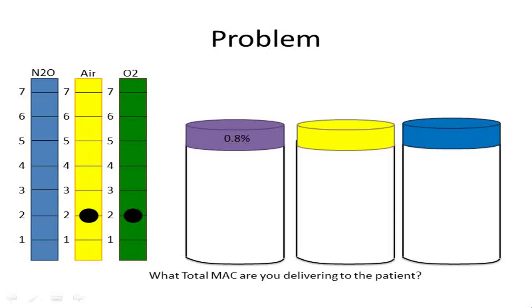No. But what's your FiO2 here? First thing you say, even if it's not on, air has 210 mLs of oxygen. That's the first thing you say. I've got 2 liters of air, so I have 2 times 210 mLs of oxygen in that air. So that's 420, plus I'm delivering another 2 liters, so that's 2420. Everybody see those numbers? Divided by what? 4 liters total flow. So that should be roughly 0.605 as your FiO2.